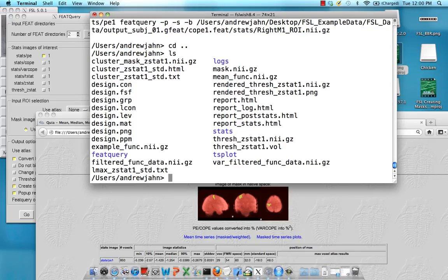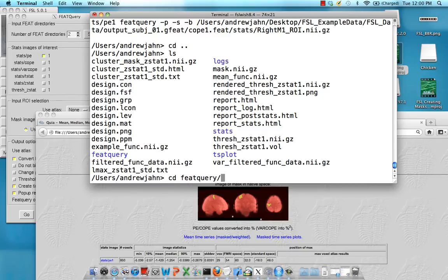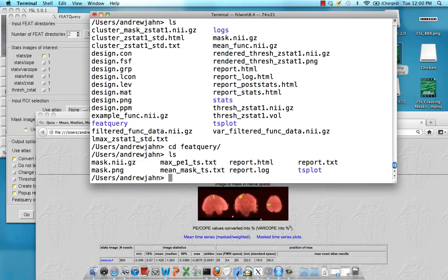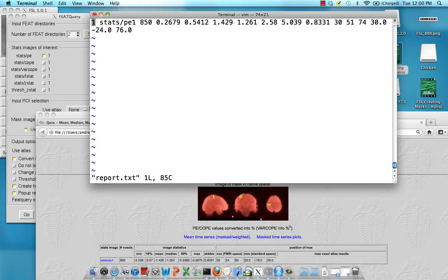So that was all output into this directory right here, featquery. And if you go within there, focus on this report.txt file, which represents all the columns that you saw in this HTML output file.